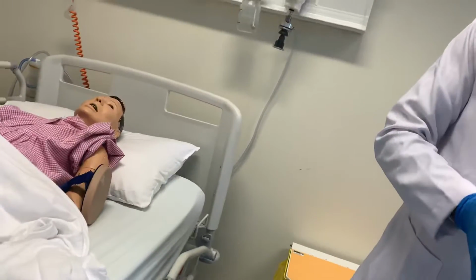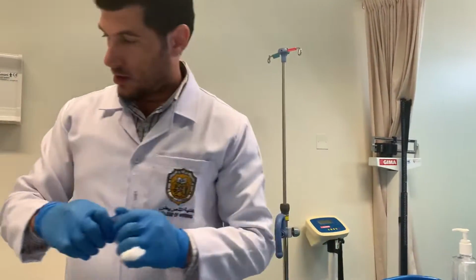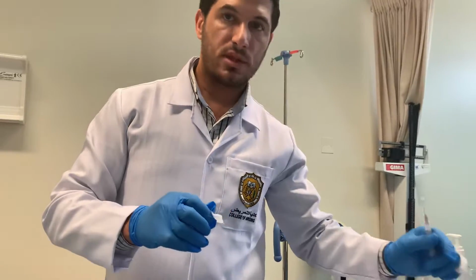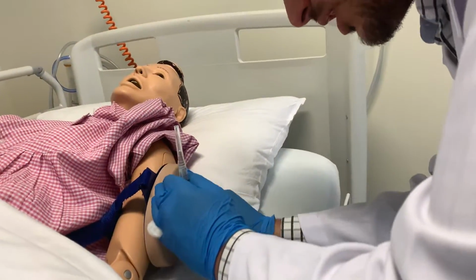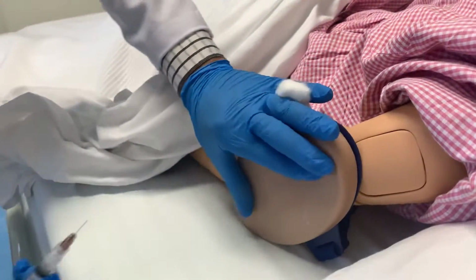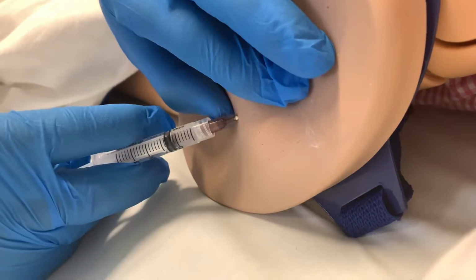So we decided to give in the upper arm. We prepared our medication. I will keep the cotton ball with me to put it on after I finish the subcutaneous injection. For subcutaneous injection, I will go with a 45 degree angle. I need to pinch the skin. According to the landmarks, this is the area where I need to give. I will clean from inside to outside. Then I will prepare the injection. I will pinch the skin at a 45 degree angle, and then I will give my injection.